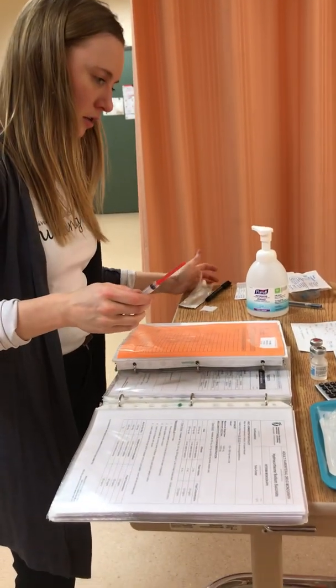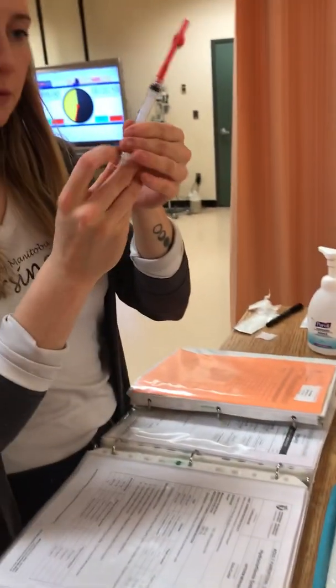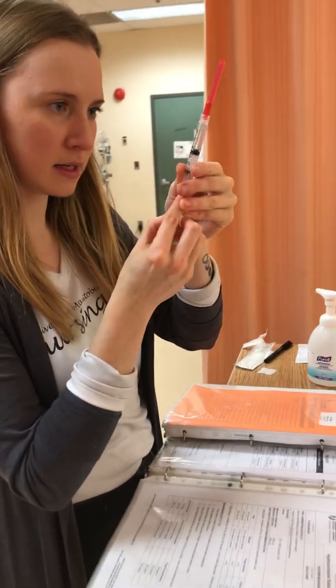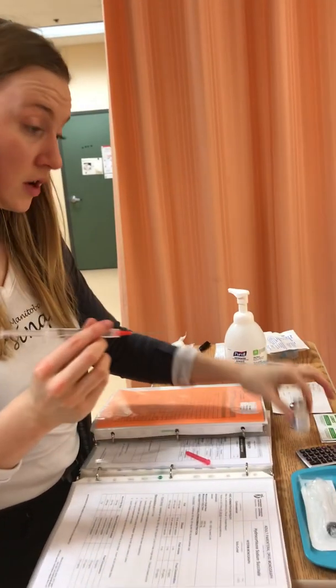So I'm grabbing the 1.8 milliliters of water. Great, so this is dried already.